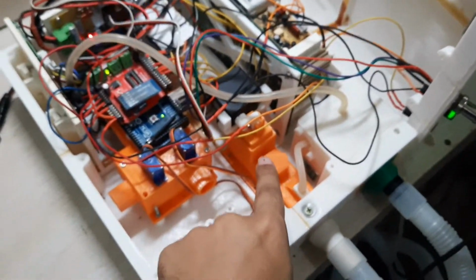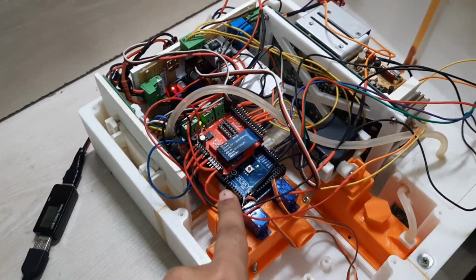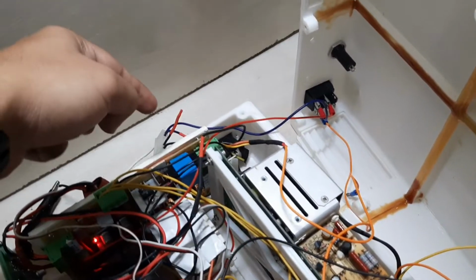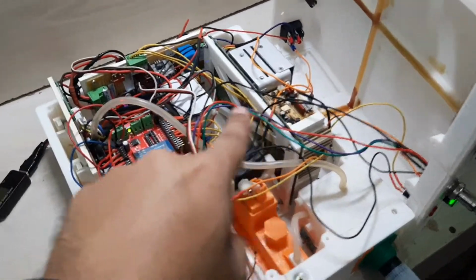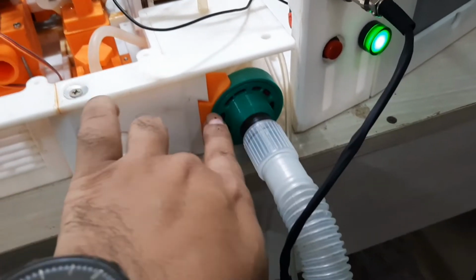And now here you can see the pressure release mechanism, and then this is the Arduino Mega. Beneath this Arduino Mega there is a turbine, and this is the circuitry, and here is another power supply. If we want to apply 220 volts directly here, we can, and this power supply will transfer the power. But for now, for testing purposes, we are transferring power from this portable power unit, and here we are monitoring the entire power.